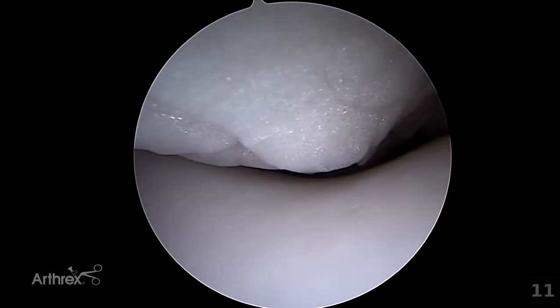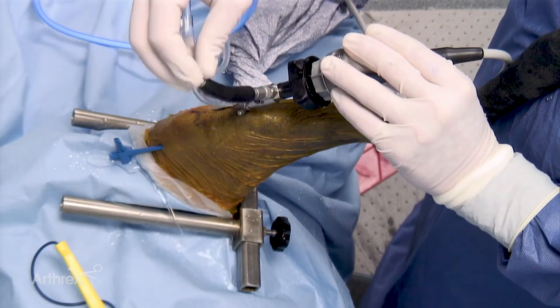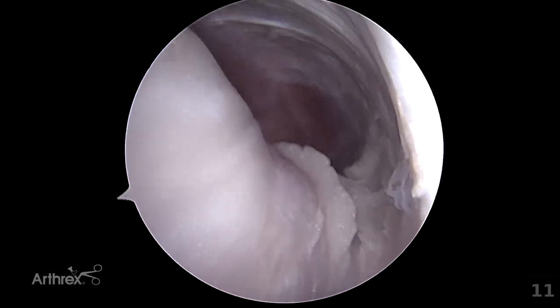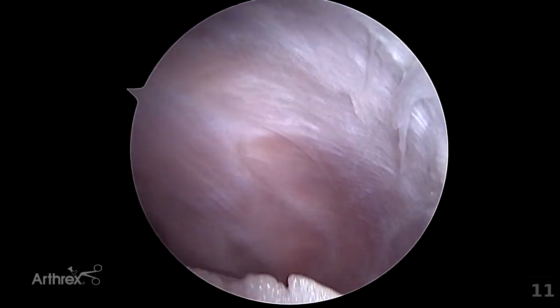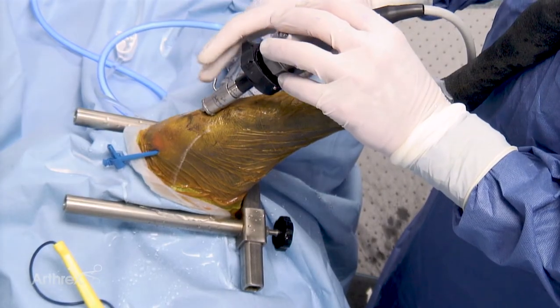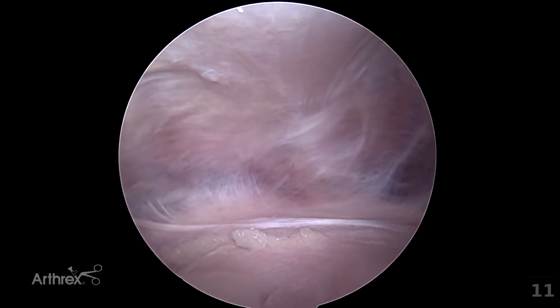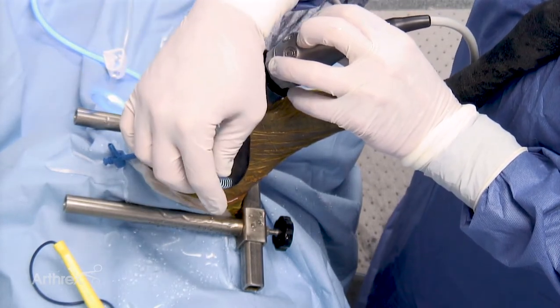To achieve access to the suprapatellar pouch it is often beneficial to move the scope into the lateral joint recess. That lateral recess can then be followed until one is in the proximal aspect of the joint. At this stage moving the scope over to a central position is needed. By stabilising the scope and moving the post one is able to look into the most proximal aspect of the joint pouch. Rotation of the post allows one to assess this area in terms of synovitis.